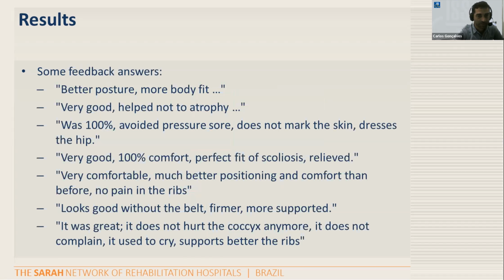So the results were very good, as we expected, since the sample is just a small piece of the work that we're doing throughout the network nowadays. And the patients report a better immersion, better comfort, better positioning, and also greater time in the seated position.